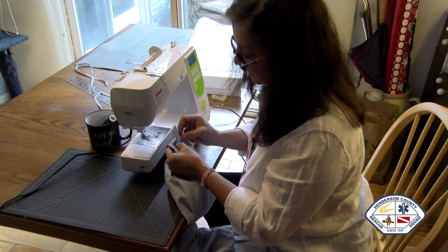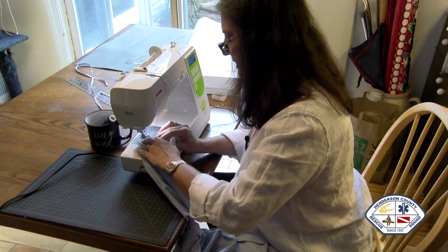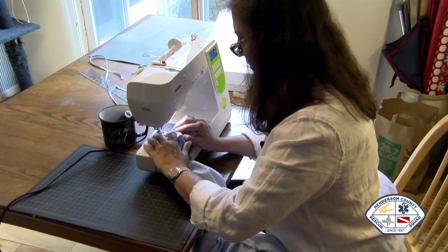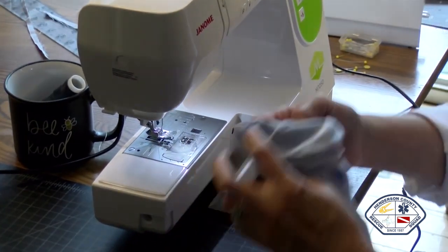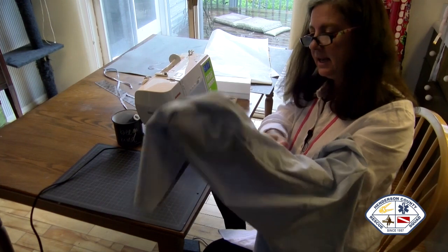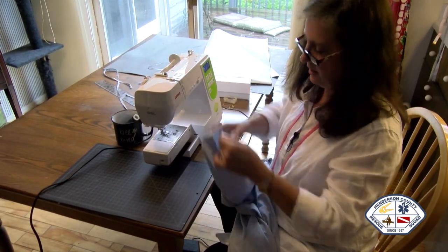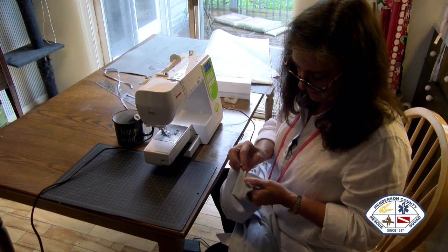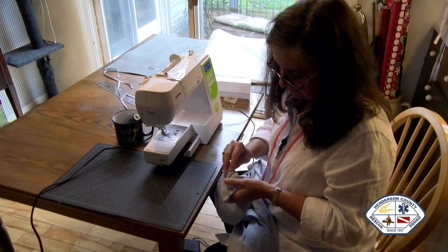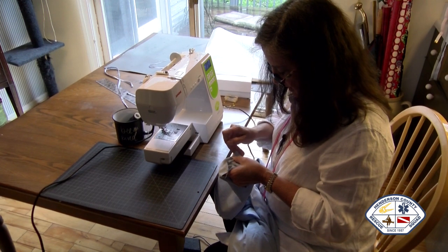You know, it would have been a whole lot easier to do before we sewed it down. On the next sleeve, let's do it the right way. Let's just look at the next sleeve. Hang on. Don't go anywhere. Let's flip this thing out. Okay, here's our piece that we are going to pin it open.